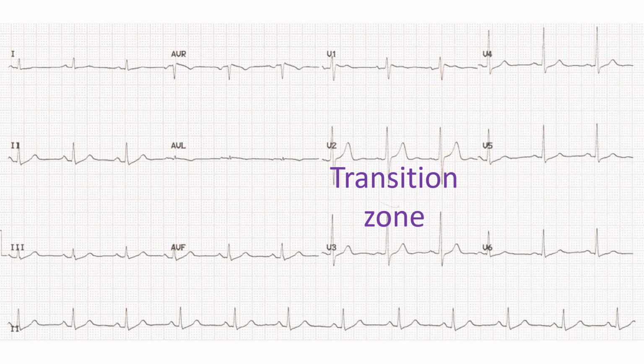When transition occurs earlier, as in V2, it is called early transition of QRS pattern, and if it occurs only in V5 or V6, it is called late or delayed QRS transition. Late transition with RS pattern extending up to V6 is seen in emphysema, where the heart is more vertical and pushed down, so that QRS patterns similar to V1 are recorded in all precordial leads.